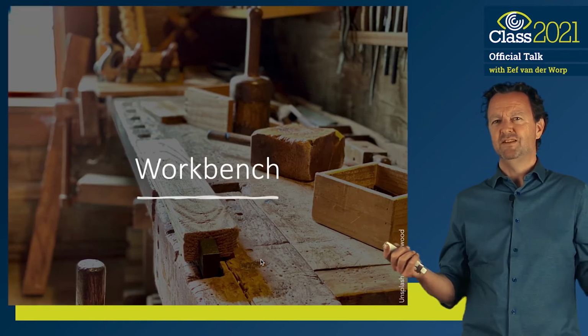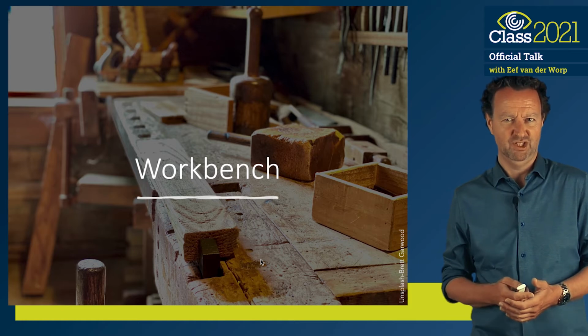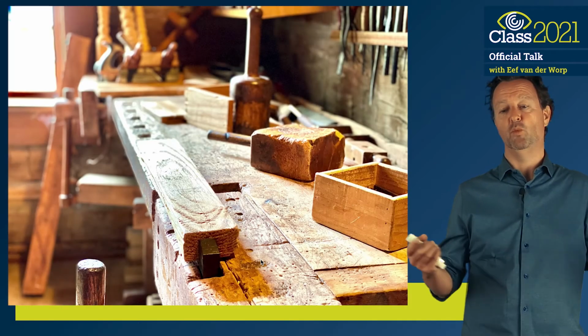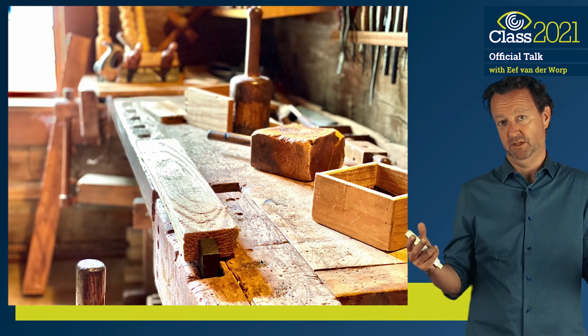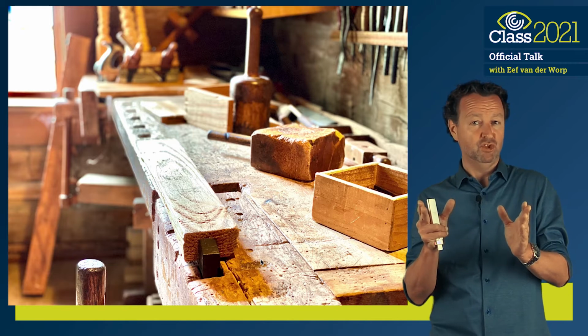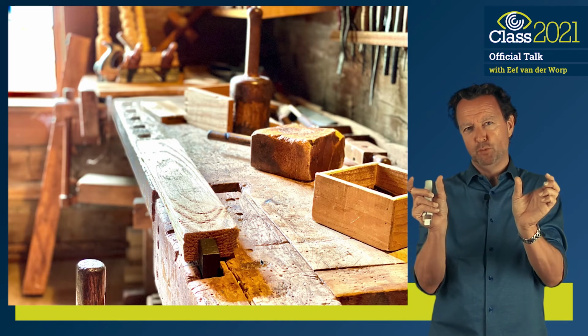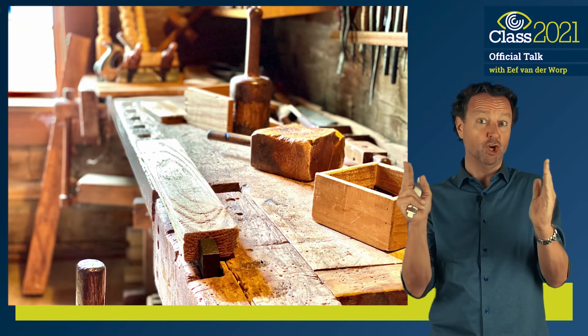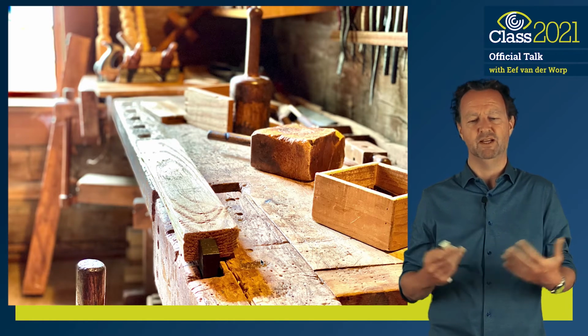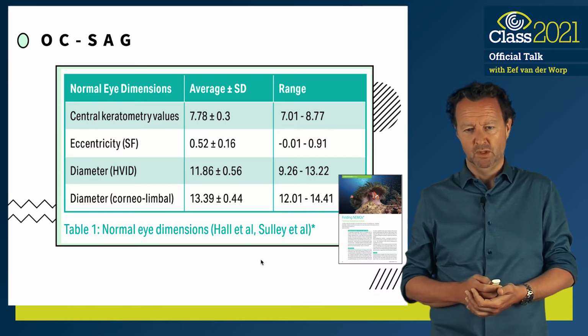So in essence, what is our workbench? Well, when we talk about soft lens fitting, we're looking at a workbench of 15 millimeters. That means a lens is 14.2 maybe, and then maybe 0.3 millimeter of movement on each side. So that's why we came up with 15 millimeters as a benchmark.